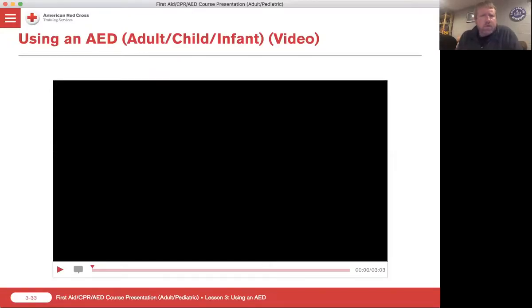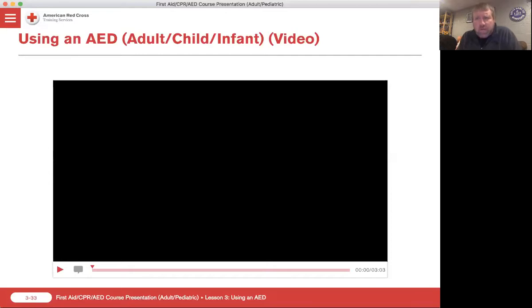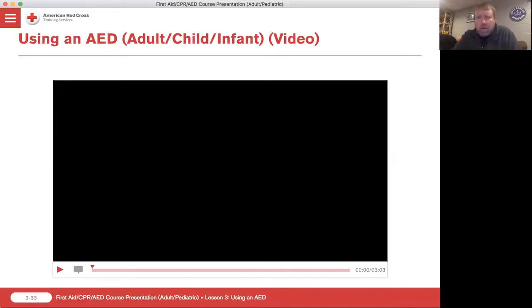All right. So let's talk about how we are going to use an AED. We're going to use this right-across video because I think it shows it pretty well. I want you to cross over into thinking not just about the AED, but also about how CPR is intermingled with AED use. Let's take a look.